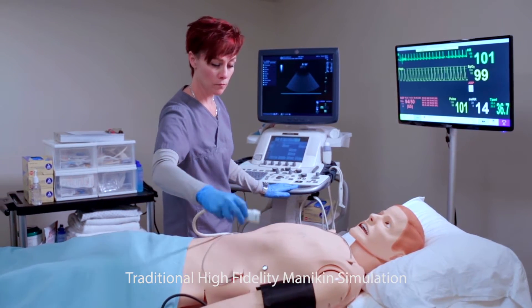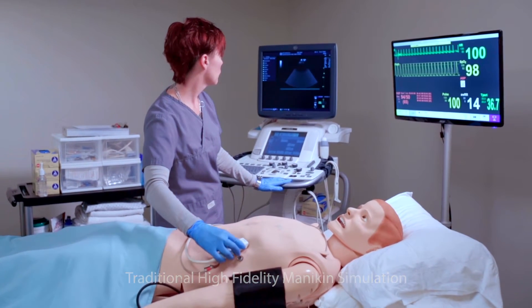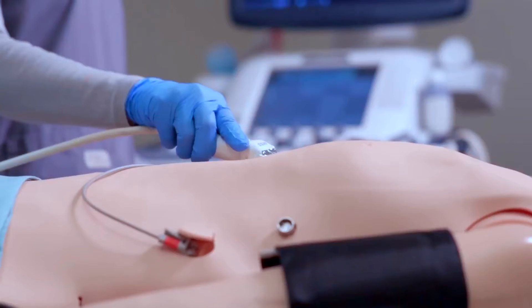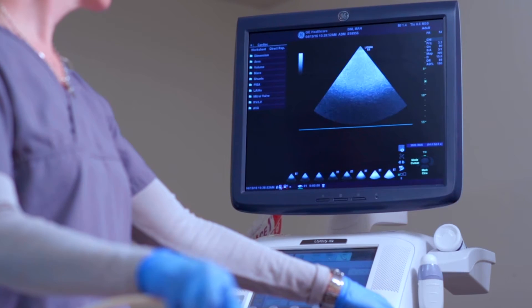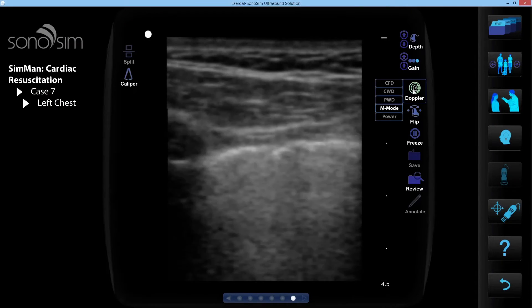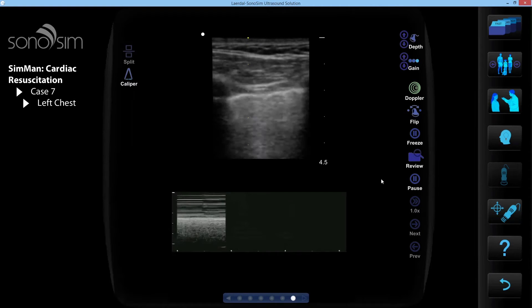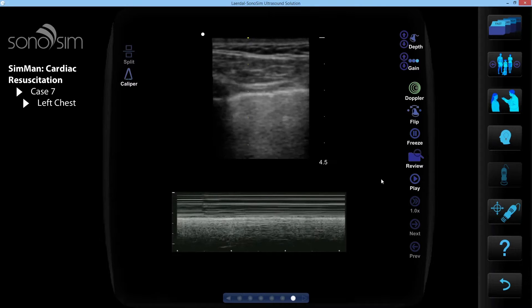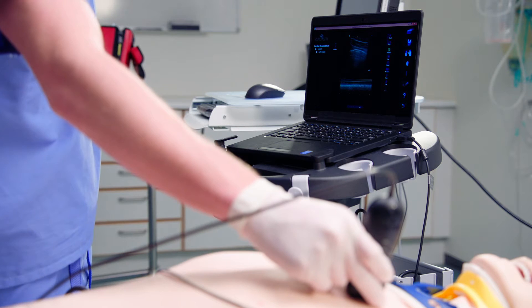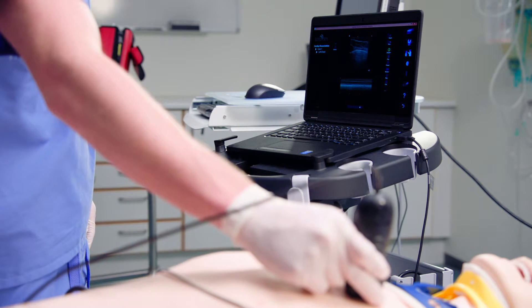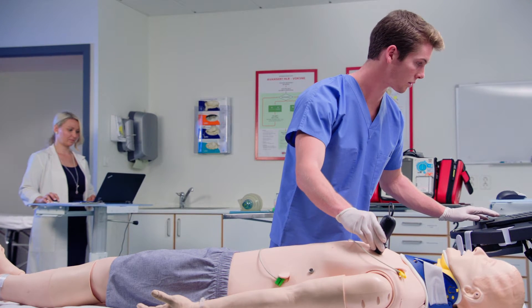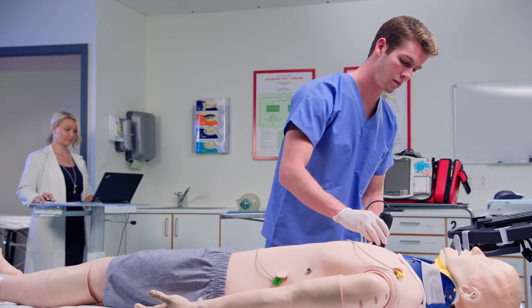Traditionally, the use of ultrasound within simulations has been limited. Most high-fidelity simulation mannequins have no ultrasound-compatible components. Because of this, ultrasound image acquisition—a key component of ultrasound use—could not be replicated. By integrating Sonosim's ultrasound training technology into the Lairdahl Patient Simulator platform, the Lairdahl Sonosim Ultrasound Solution now combines clinician-operated bedside ultrasound use with full-scale, life-like simulation sessions, resulting in a simulation experience that mimics the care of critically ill patients in top medical centers today, providing groundbreaking medical training.